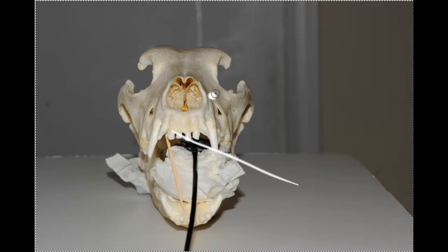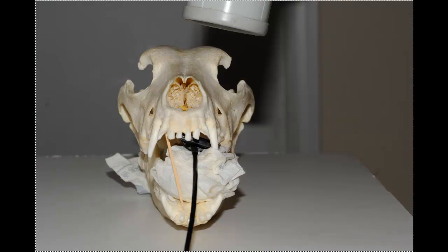Here we have the apex of that canine, and if we were to come down vertical as viewed from the front as well, we might get that apex superimposed on some of these premolars here. So in order to separate and make sure that the premolars are not superimposed on the apex of the canine, we're going to bring the tube in at about 1 o'clock as viewed from the front. And what this should accomplish is that the x-rays hitting the apex here should cast the image across to the far side of the sensor, and the x-rays coming through the premolars here are going to record them on the other side of the sensor.